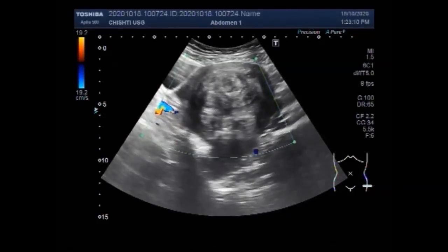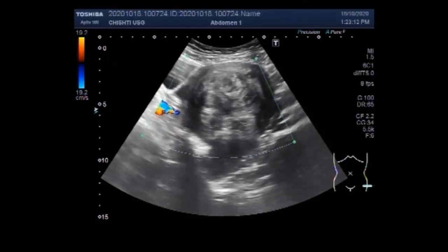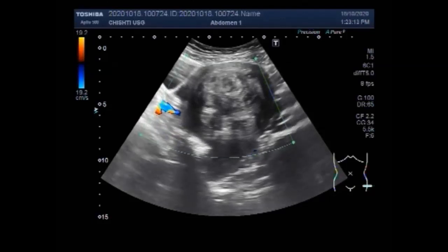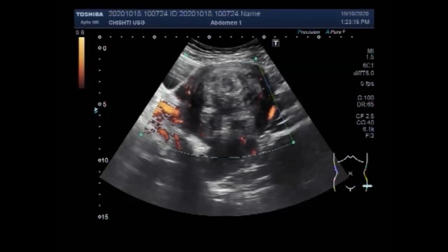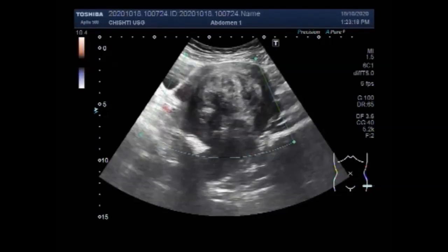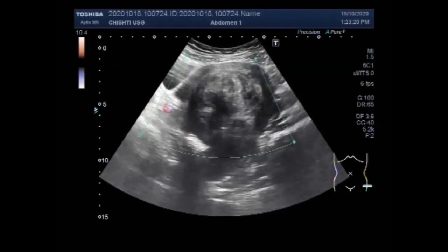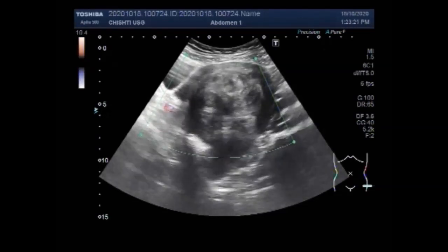Now you can again see the large uterine fibroid and blood flow. Only a small amount of blood flow is seen in the rim region.